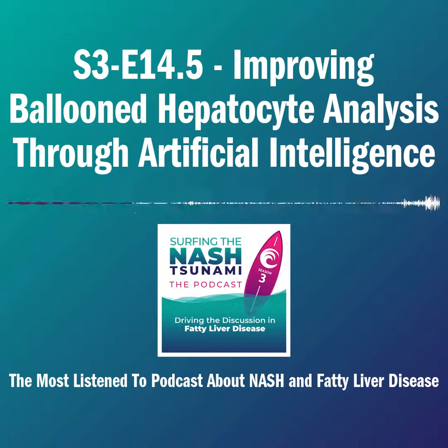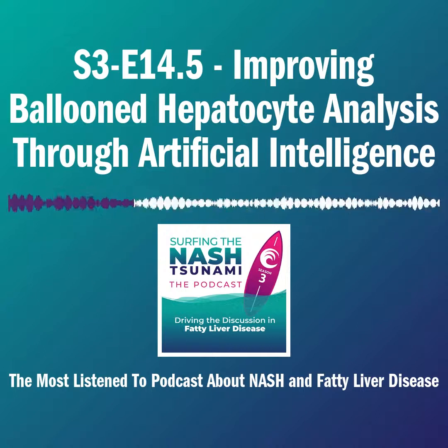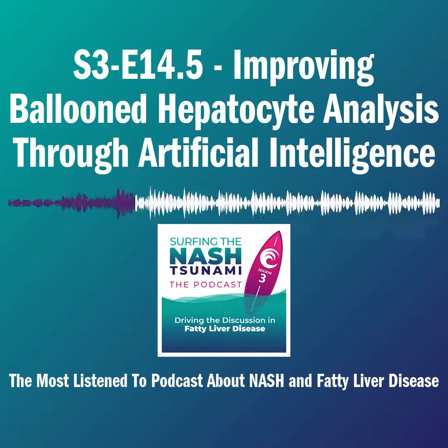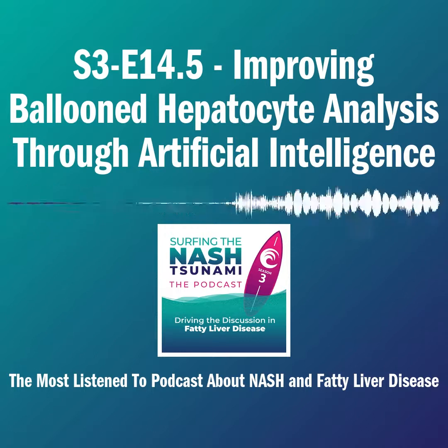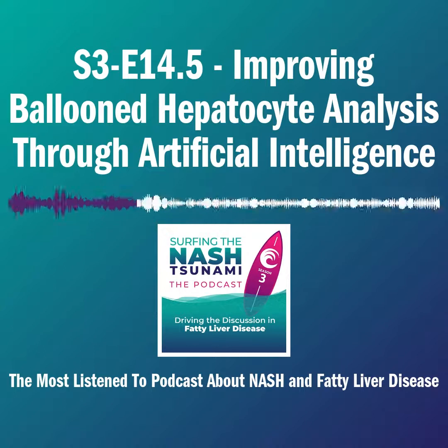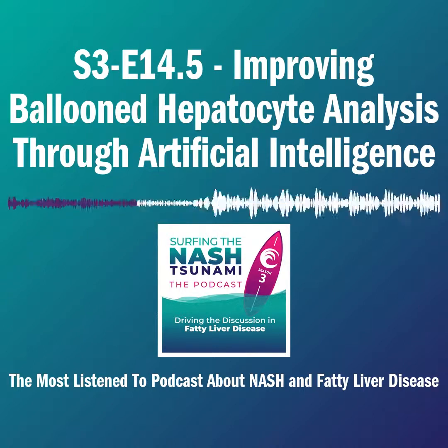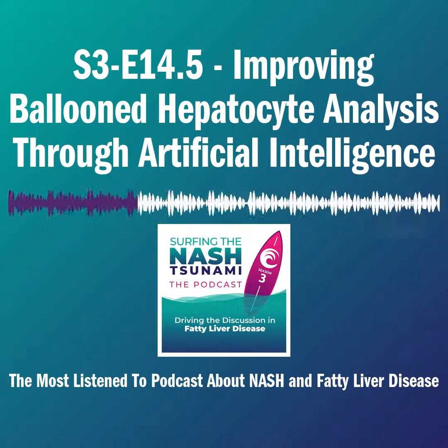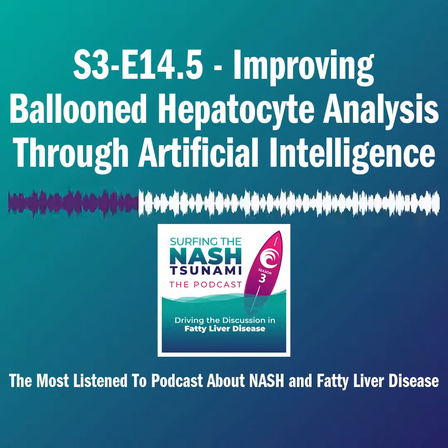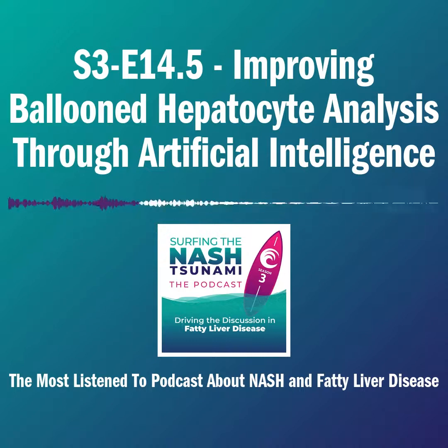The thing that came up to me now listening to Quentin is, if it's not about the training of the histopathologist, then even if you're highly trained, there are no clear rules, because there's no clear picture. There's not this one ballooned hepatocyte. It's biology. They don't always look the same. I think that's what it comes down to. And then it depends on your personal experience, the amount of tissue you've seen over your career, and maybe other factors, whether you call it ballooned or not. So again, quantification versus semi-quantification, there is no yes or no answer to this, is what it comes down to for me. And I think that's why it's so important to loop in the machine and augment the histopathological call. Let's say it that way.